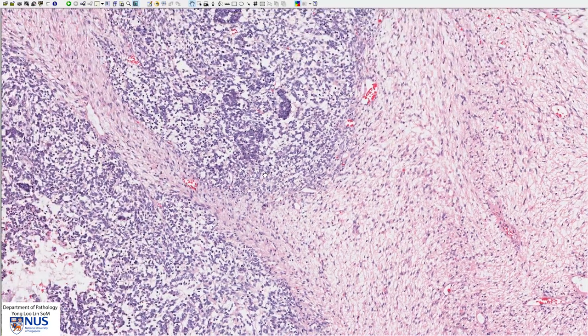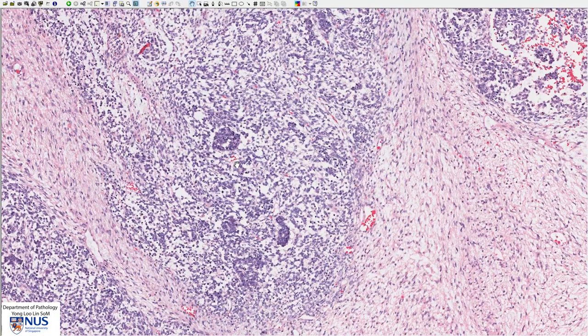In some tumors there is also a phenomenon known as anaplasia, and this is not seen in this current tumor. Anaplasia is when we can see extremely bizarre-looking, very markedly enlarged nuclei which are hyperchromatic and also show abnormal mitotic figures. The presence of diffuse anaplasia is a poor prognostic feature.